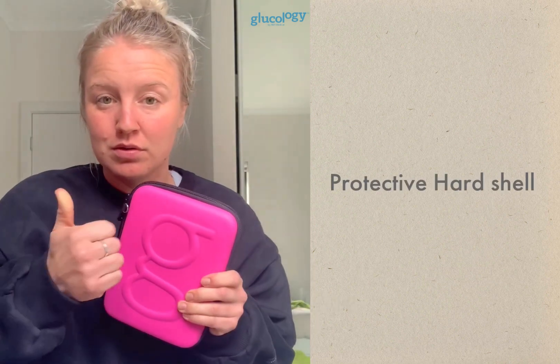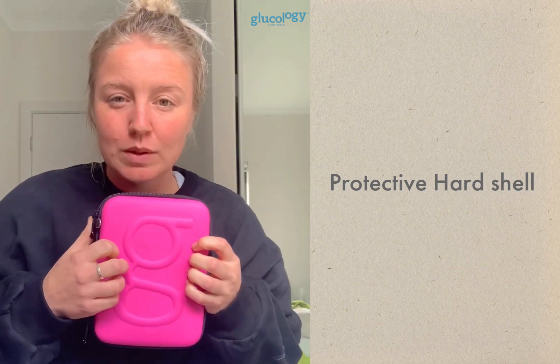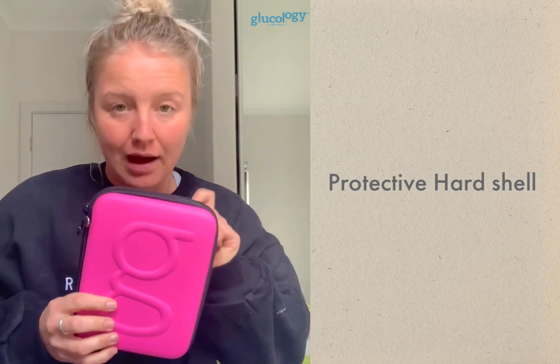Both cases have a hard shell on the outside with a kind of foamy feeling — you can hear it when I knock on it. They both have two zips on the outside, and the original has a little loop where you can attach a keychain or lanyard. The travel case plus does not have that loop.